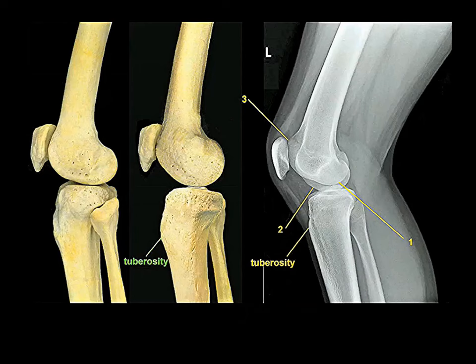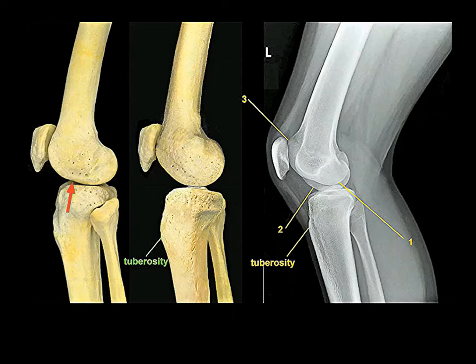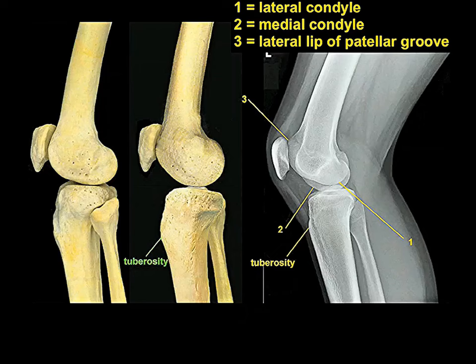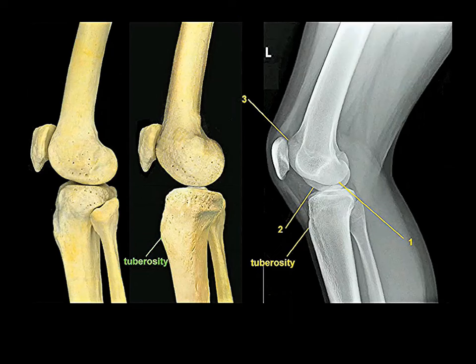The femoral condyles are not shaped symmetrically. There is a little area of concavity in the lateral condyle that doesn't exist in the very round medial condyle, and you can identify this on a lateral film. The most prominent lip of the patellar groove is the lateral one, and you can trace it in continuity with the lateral condyle of the femur.